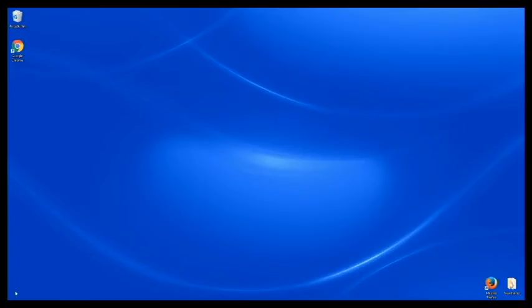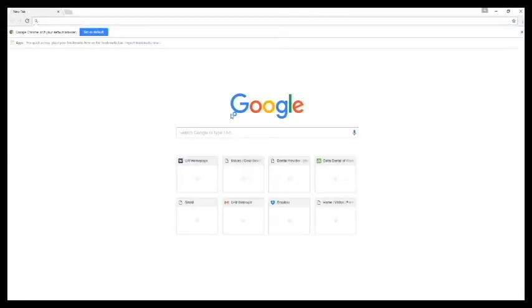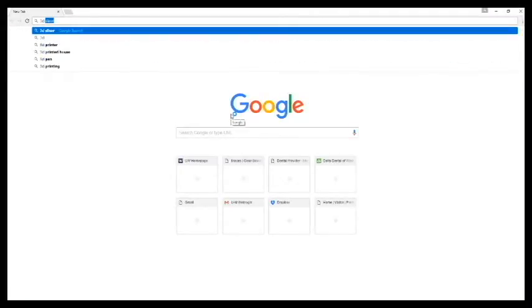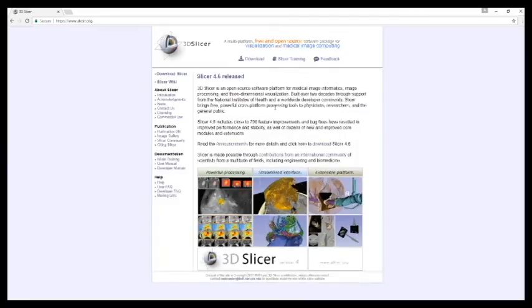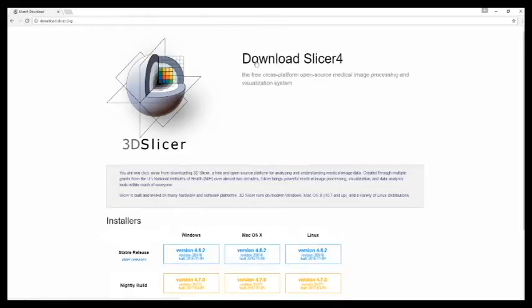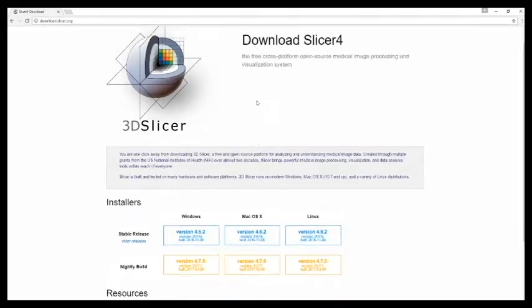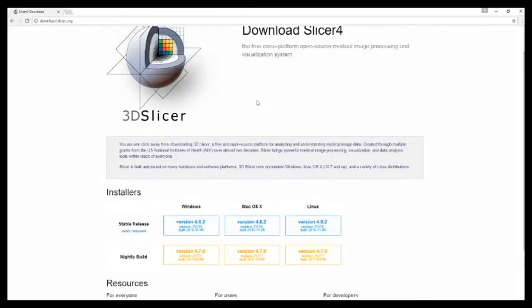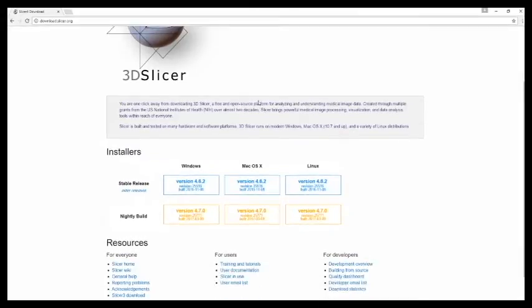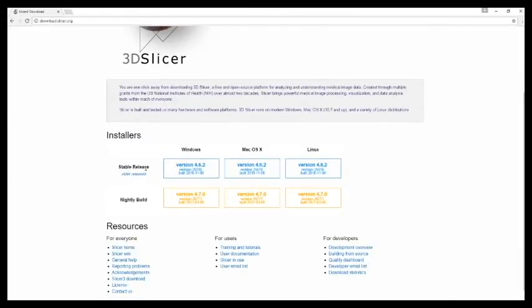First we will need to download 3D Slicer. Let's just come to the internet. 3D Slicer is free. Here at the top you can choose download, and I'm using Windows so I will choose a stable release here and download. I've already done that.